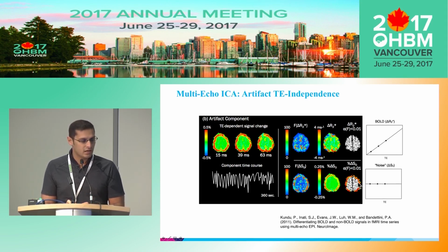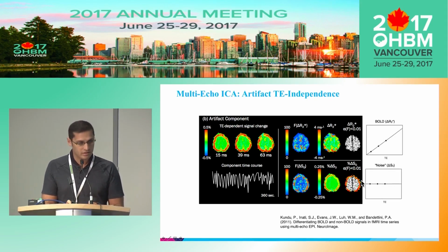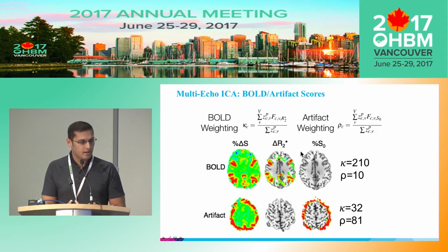So visually, you can see the rationale for how, strictly speaking, you don't really need to look at where the components are localized or what their time courses are. A major amount of information is gained from looking at how the effects scale with percent signal change. So the summary picture looks like this. In addition, we don't want to look at pictures of what loads onto what. The effect is sufficiently strong that we can come up with a pseudo F statistic to describe the component-level weighting per effect.